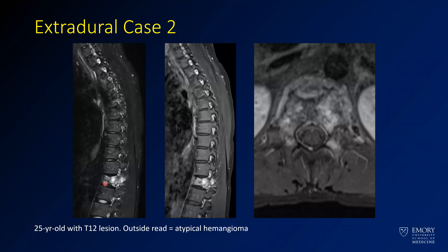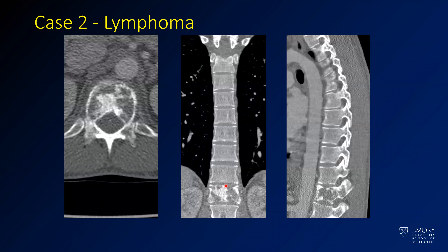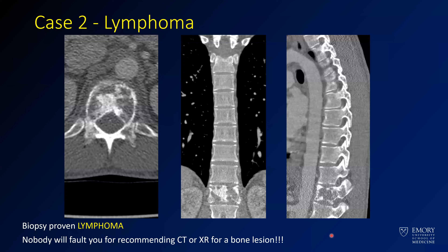Here we see a primary bone lesion in the T12 vertebral body. It's bright on T2, enhancing on post-contrast fat-sat, and avidly enhancing on axial post-contrast. This got called an atypical hemangioma, but on CT, it doesn't look typical for a hemangioma at all — it looks very aggressive, with some pathologic fracture and involvement of the pedicle. The patient had a progressively worsening lesion that ultimately had to be biopsied, and it was B-cell lymphoma arising in the bone. If you recommend a CT or X-ray for any suspicious lesion like this, I'm pretty sure most people on CT would not call this a hemangioma.